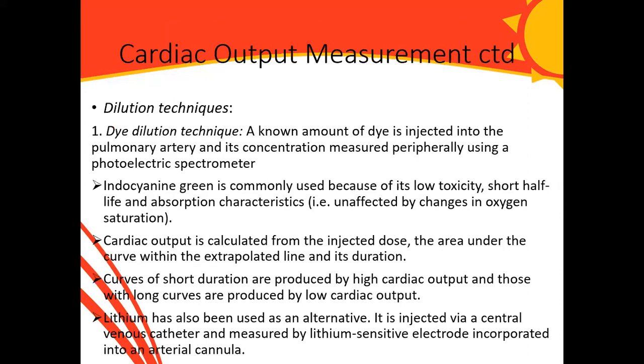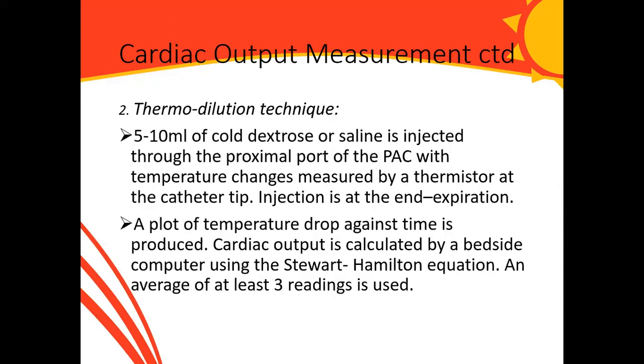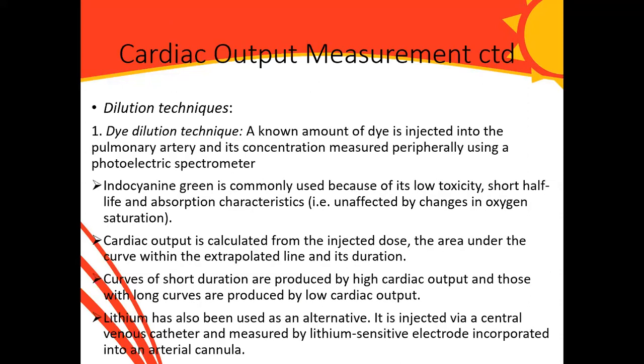The third one is the dilution techniques, which can either be the dye dilution technique or the thermodilution technique. In the dye dilution technique, you inject a known amount of dye into the pulmonary artery, and you measure the concentration peripherally using a photoelectric spectrometer.